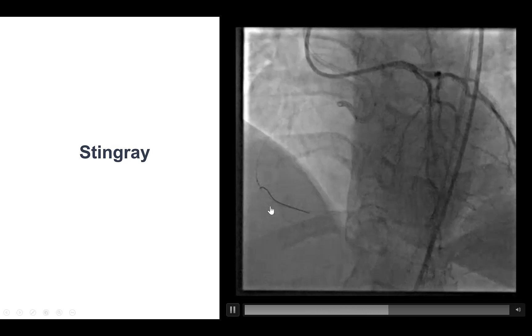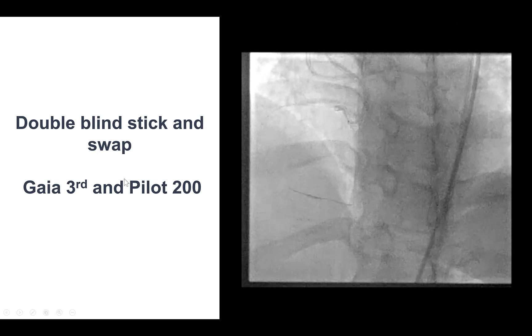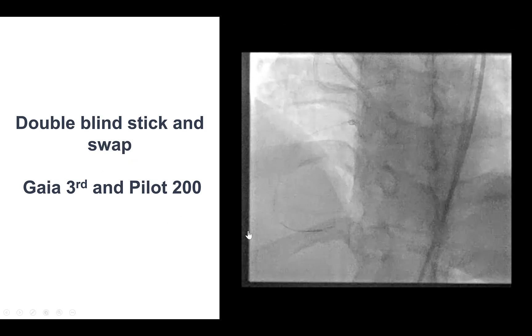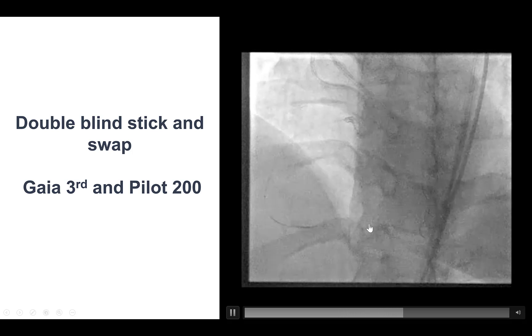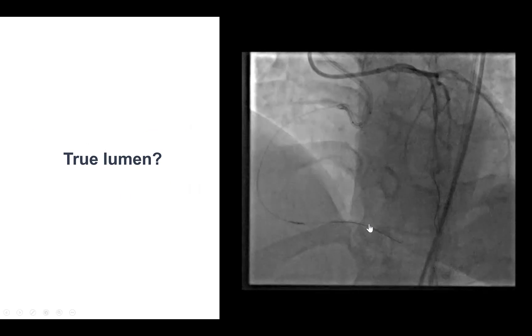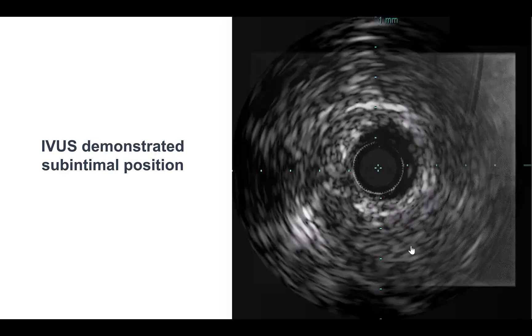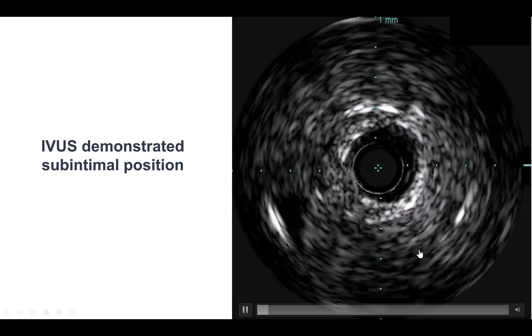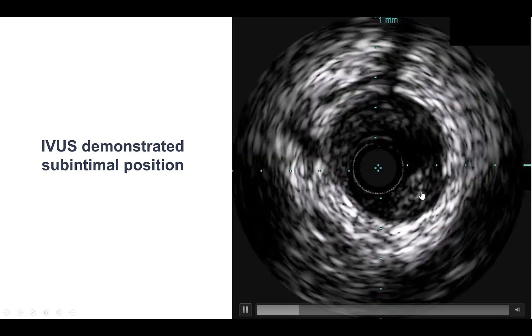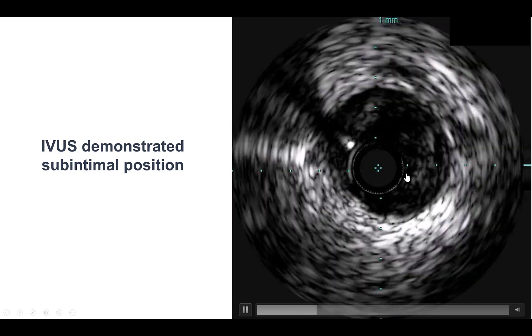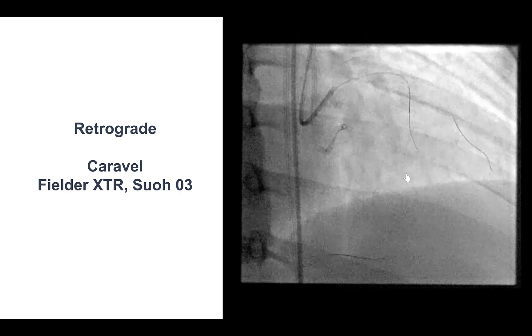We delivered a Stingray balloon to the distal RCA and did multiple re-entry attempts using the double-blind stick-and-swap technique with a Gaia 3rd and a Pilot 200, and the wire unfortunately seemed to be knuckling instead of freely moving distally. Eventually the wire moved more distally, but we were not fully satisfied with the movement of the guidewire, and IVUS was performed demonstrating a subintimal position of the guidewire. As a result, we decided to change to retrograde.